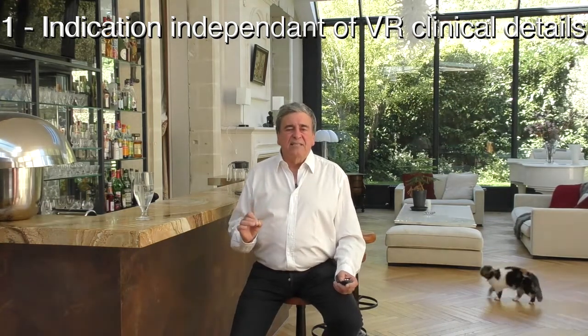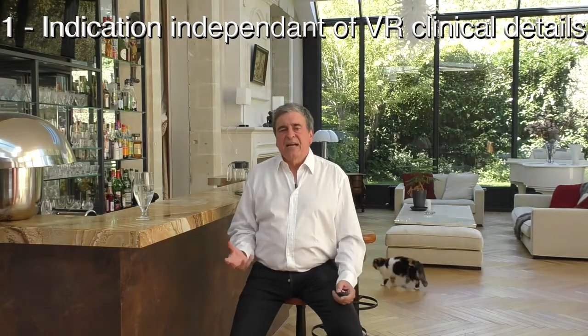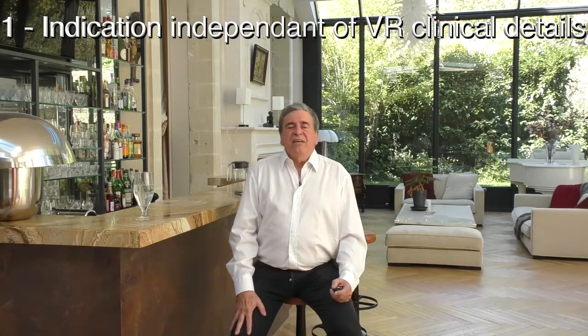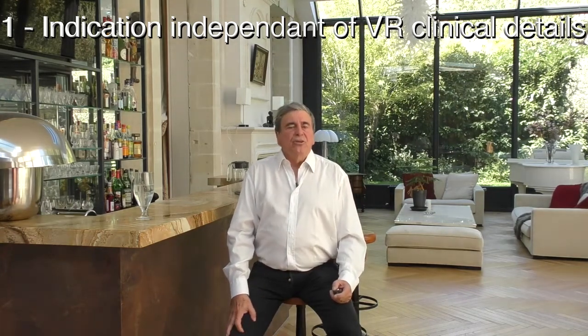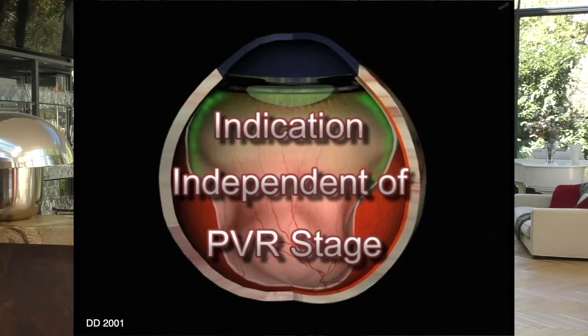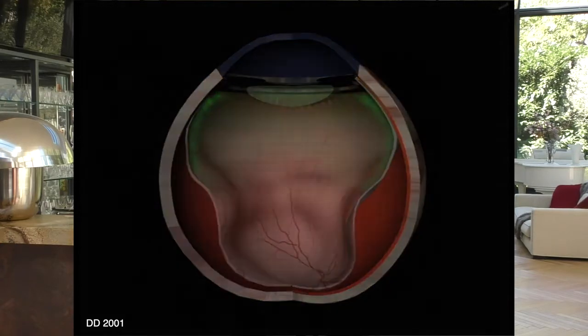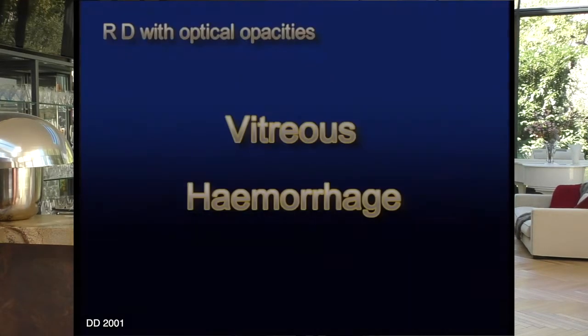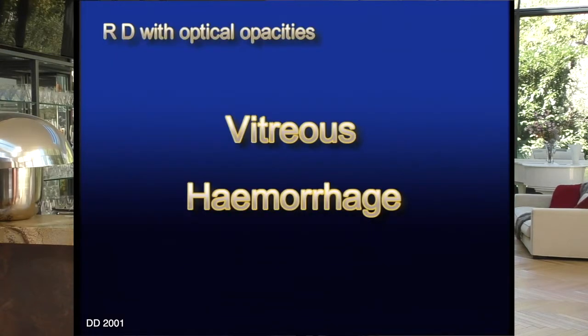These circumstances are so varied and difficult to classify that the EVRS-RD study could not study them. Whatever the stage of the PVR, we can carry out a vitrectomy in different circumstances. First, RD with optical opacities. We can perform a vitrectomy when a vitreous hemorrhage is present.